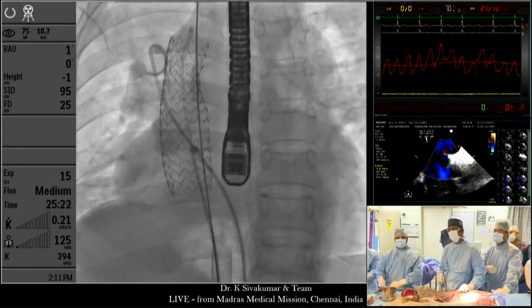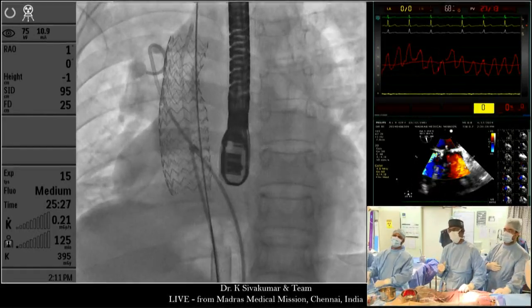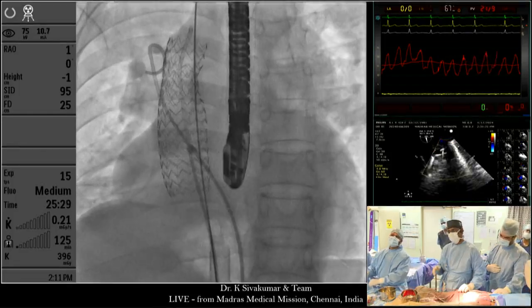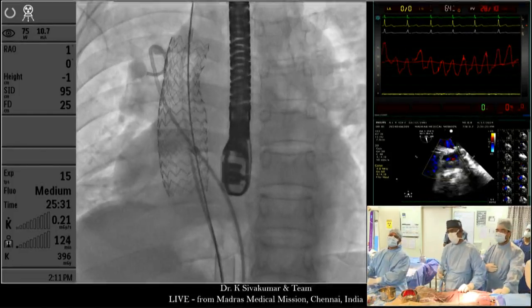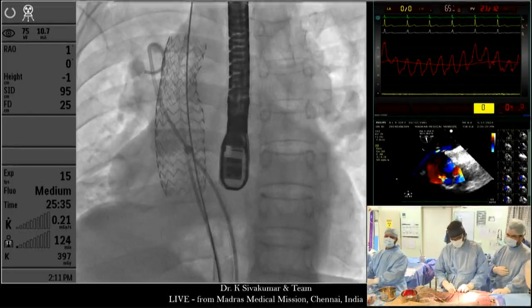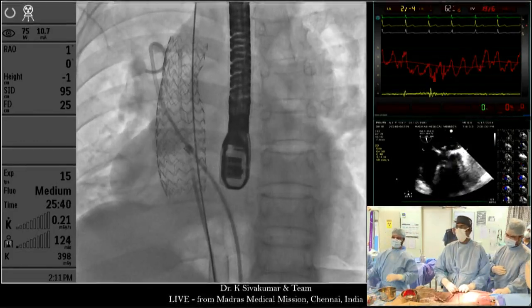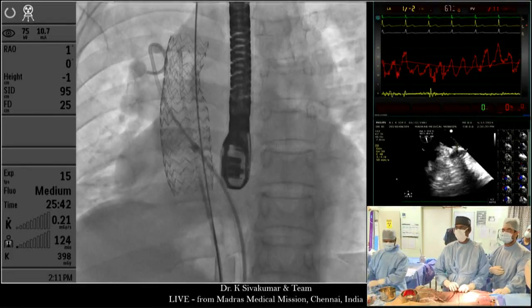She has never undergone any surgeries so far, and she's on positive pressure, full ventilation. So even if there is a diaphragm palsy, the diaphragm should move. Probably something like an eventrated diaphragm. I will look into it, however, we didn't see that. Yeah, no problem. Take it out.